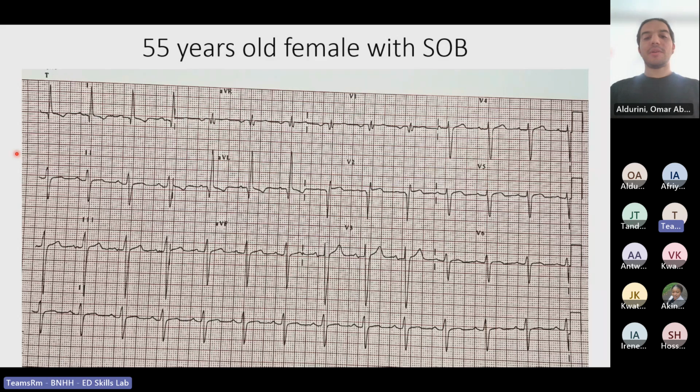Can you help me with the waves? Is there any T wave in specific that is pointing downwards? So we've got lead 2, lead 3. Let's start here, lead 1. Is it pointing upward or downward? Down, but it's supposed to point up. Okay, so it's pointing downward. In lead 2, it's pointing up, and lead 3 is pointing up.